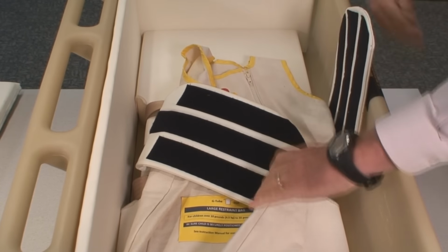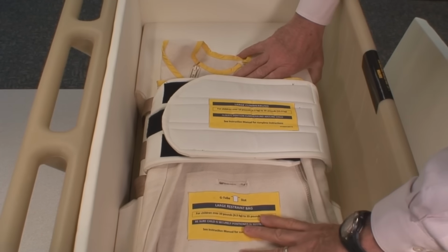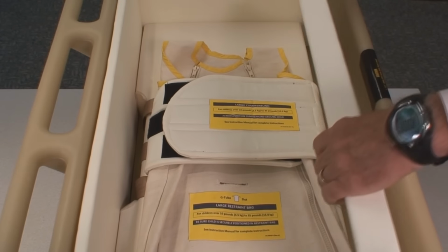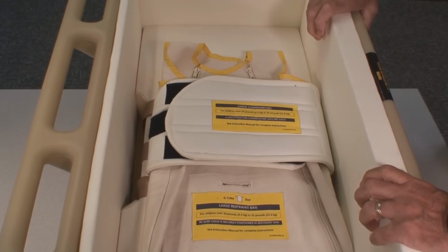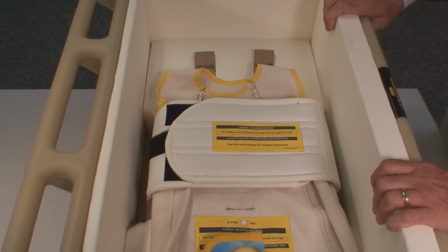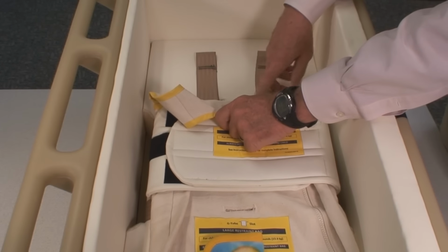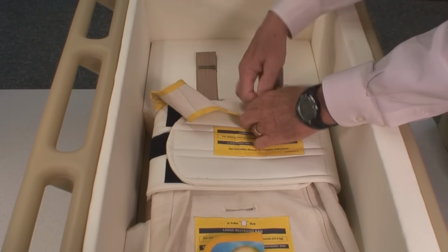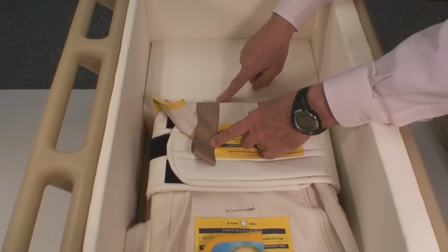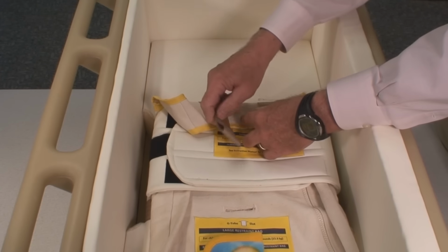Push the cushion down. Once we have the restraint bag installed, we push the 3-inch cushion back to its position, and we install the 1.5-inch EPS foam. The last operation to get the restraint bag installed is to insert the shoulder straps into the slots on the 3-inch cushion. You'll note there are 2 slots. The top slot is for the 3-point harness. The bottom slot is for the restraint bag.